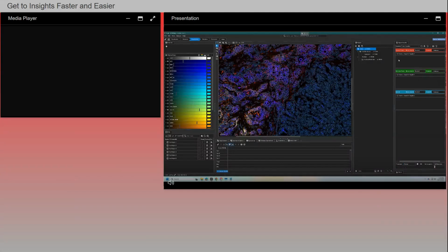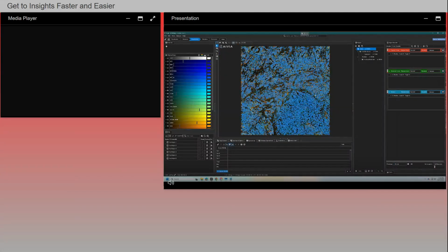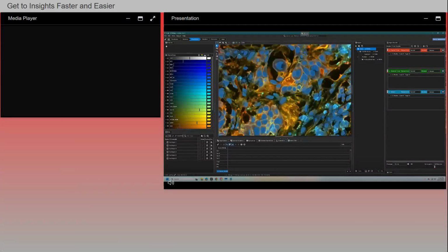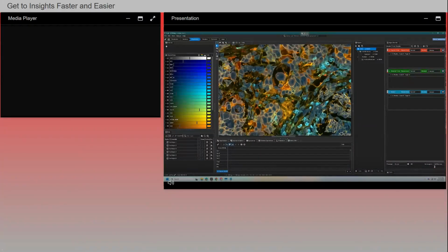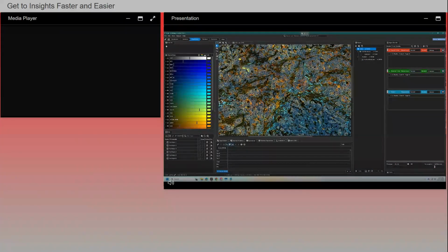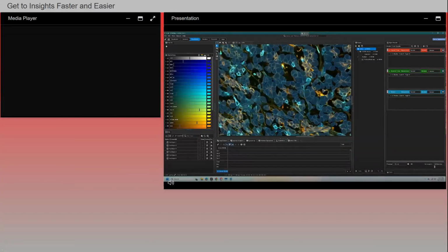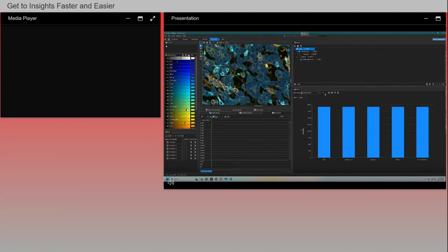Once that's done, there are different ways of trainings. For example, one option is for you to visually inspect. So zoom in, I'm going to turn off the nuclear membrane and see which of these cells are, let's say, looking over here where I expect, based on visual inspection, normal cells. You can actually look for cells, right click, and then assign the cell individually to normal tissue. You can select multiple, for example. Or I'm going to show you some cool ways of classifying cells at this point.